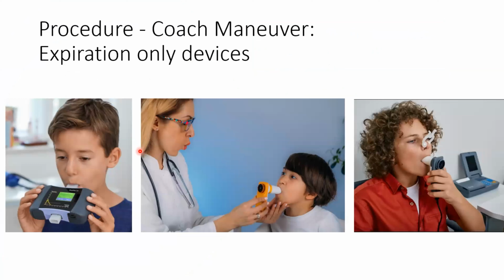Here's our nod to the expiratory only devices. The expiratory only devices still use the same 4 maximums, but they don't breathe in through the device. So they're going to do their normal breathing and their maximal inspiratory breathing to TLC before they put the device in their mouth. Once they have inspired to TLC, then they put in the mouthpiece and blast out.